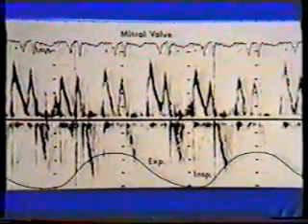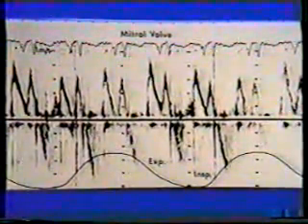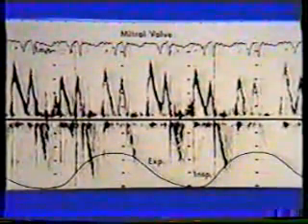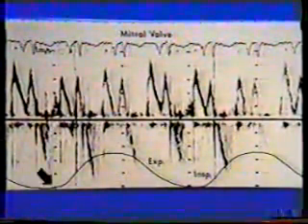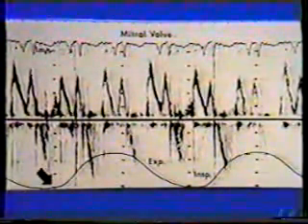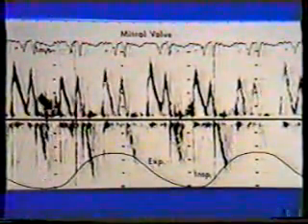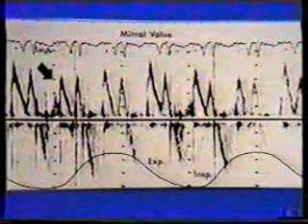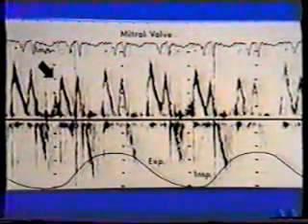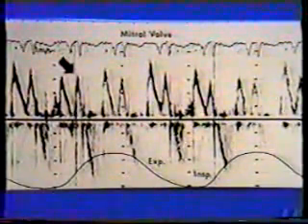This is a pulsed wave Doppler recording from a patient with constrictive pericarditis. The sample volume was placed between the tips of the mitral leaflets. Remember that inspiration mechanically begins slightly before the upstroke on the tracing from the nasal respirometer. Notice that the mitral spectrum decreases with inspiration. The decrease is greatest for the first beat of inspiration, and it affects the E velocity to a greater extent than the A velocity.